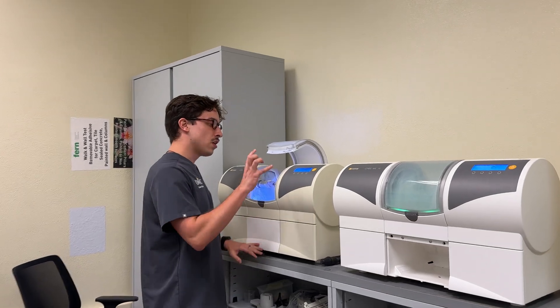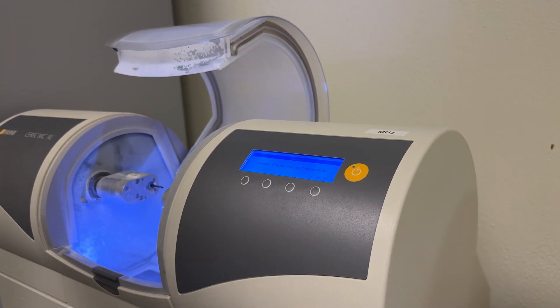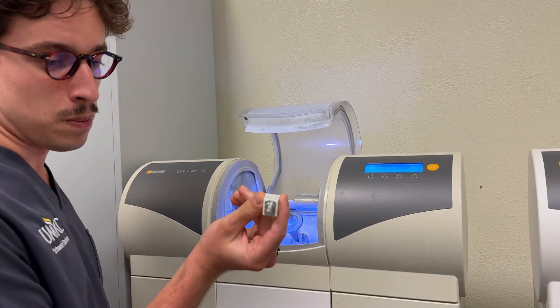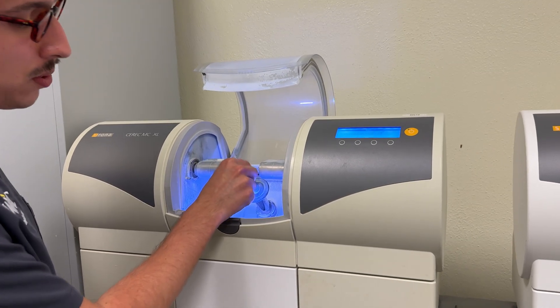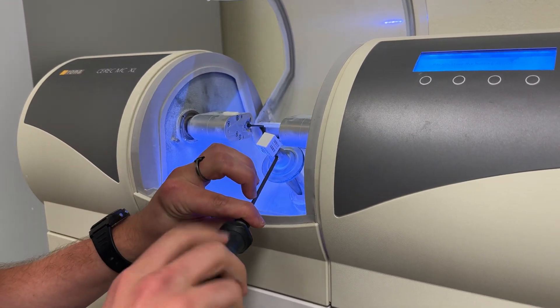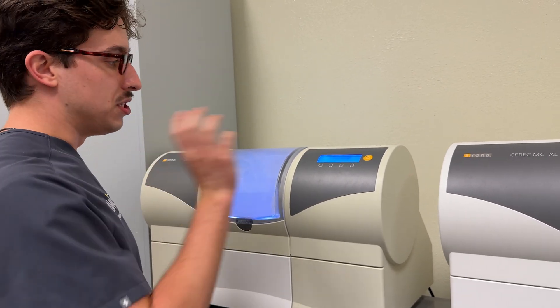Looking at milling unit three, there's a little screen that has the same error we saw on the Omnicam: please close the milling chamber door. Before we do that, we're going to put our block in. You're going to place it right here, line up the metal portion, and then twist it around until you feel it click into place — once it clicks, you won't be able to rotate it freely. Then take the screwdriver and tighten down the small screw all the way until you hear a click. Now we're going to close the milling door.